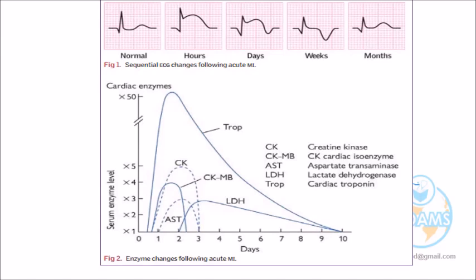Initially, we said the Q wave and non-Q MI. Nowadays, we are utilizing the terminology STEMI and non-STEMI. So if Q is there, pathological Q, this Q will be persisting for life. There will be no change.